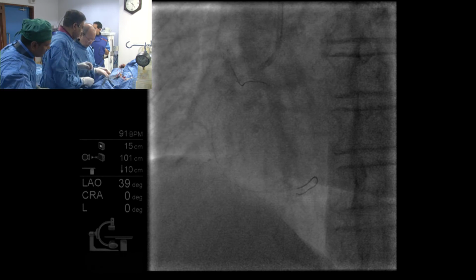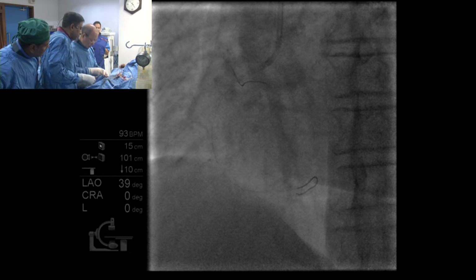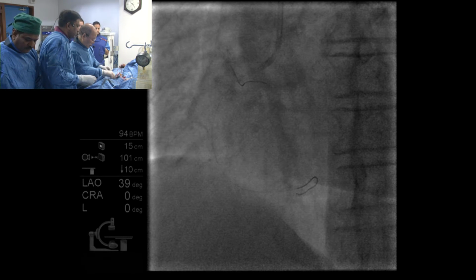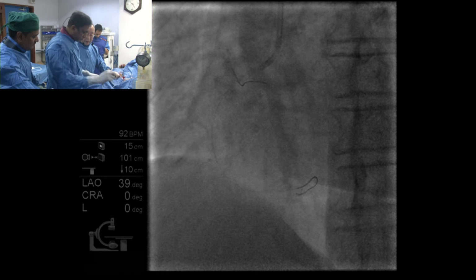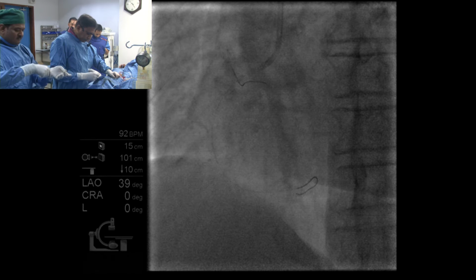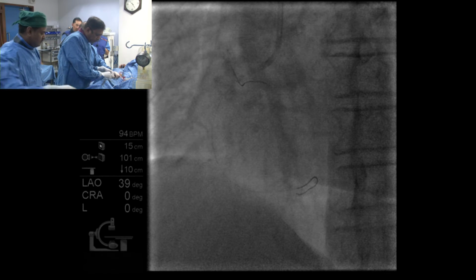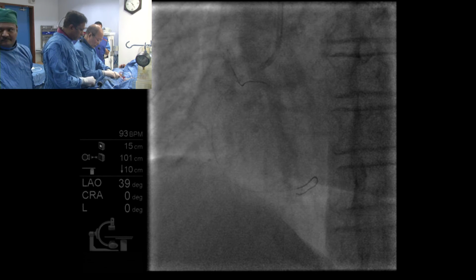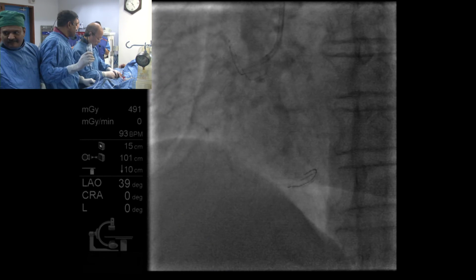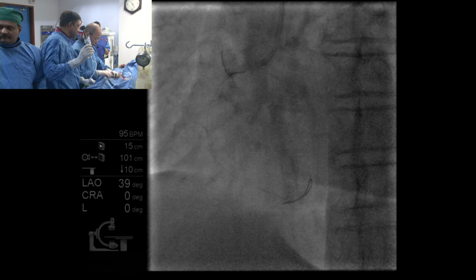Just a moment. Rajiv, to answer your question, you usually use Fine Cross or the Turnpike. Those are my two choices. How do you choose, Sammy? Any preference? Fine Cross is for the most cases, and then if I have to torque and advance, I like the Turnpike with the serrations on it. Which case do you decide to turn, and which to push? The length probably matters the most. There's probably a complex factor, but length definitely matters the most, I think.